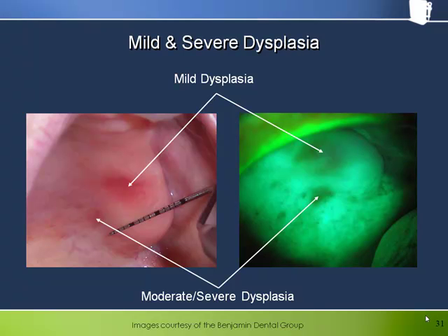This is a good example of how the Velscope can enhance the examination process of the clinician by focusing attention on areas that might otherwise have been overlooked.